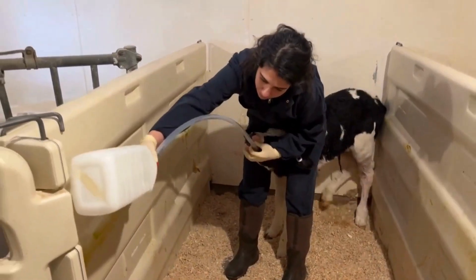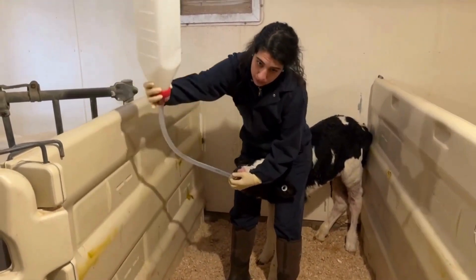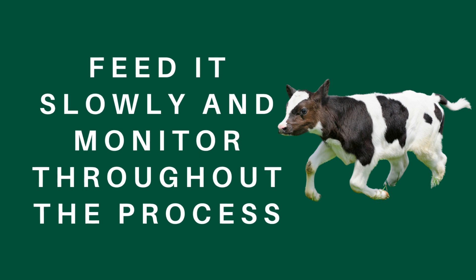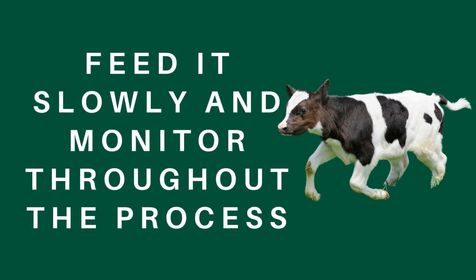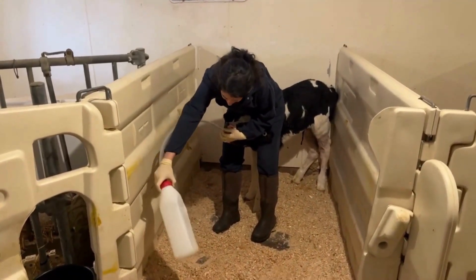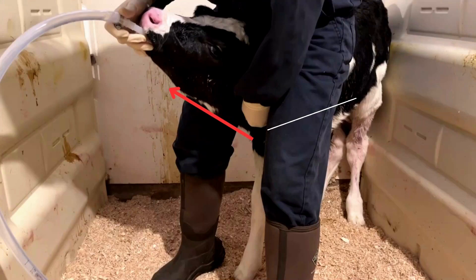Once the tube is inserted correctly, you can start feeding the colostrum or fluid. It is best to feed slowly and monitor the calf's behavior throughout the process. Lower the bottle or bag if you suspect something is wrong or want to slow down the flow. Make sure that the calf's head and neck are up above the stomach level to prevent the aspiration of liquids.